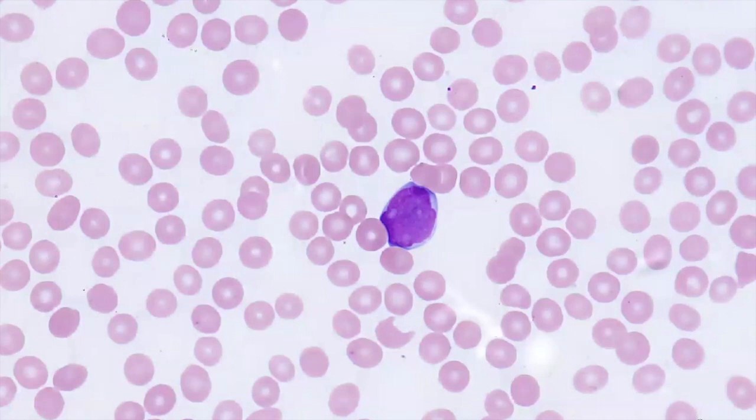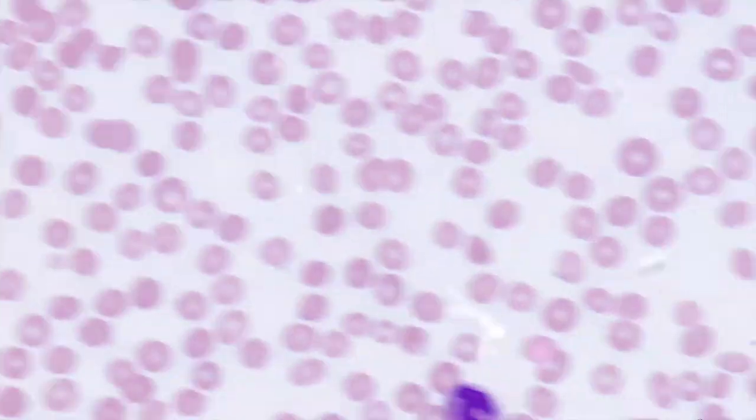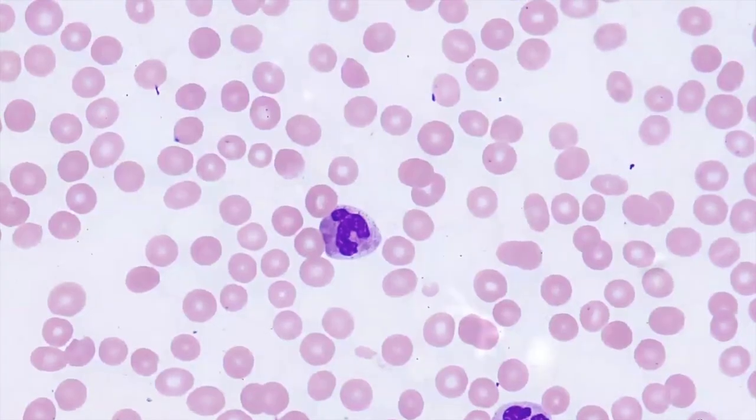So I like to think of it as sort of appearing like a fine sand. If I took my rake and I tried to drag it through a fine sand, I wouldn't hit any lumps or bumps, and it would be smooth for me to drag that rake through. In contrast, if we find a mature appearing cell, such as this neutrophil, we can see that this chromatin is very clumpy, and if I tried to take my rake through this, I would certainly hit lots of bumps along the way.